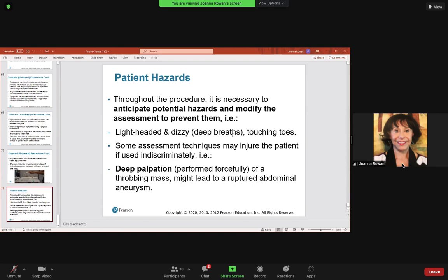Remember, every time you are auscultating the breath sounds and the patient feels your stethoscope, the patient has to take a deep breath so you can hear whether there are any crackles or any type of abnormal sounds. So, of course, if they are sick and on top of that they have to breathe like 18 or 16 times, they will become dizzy or lightheaded.